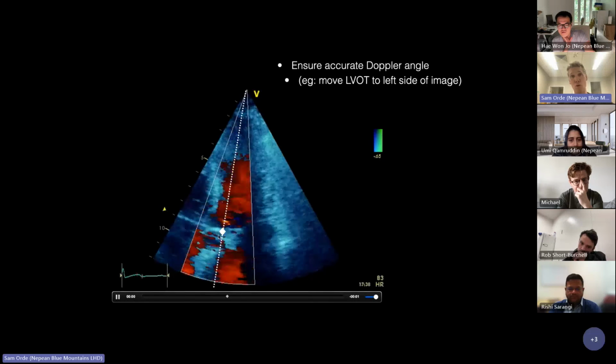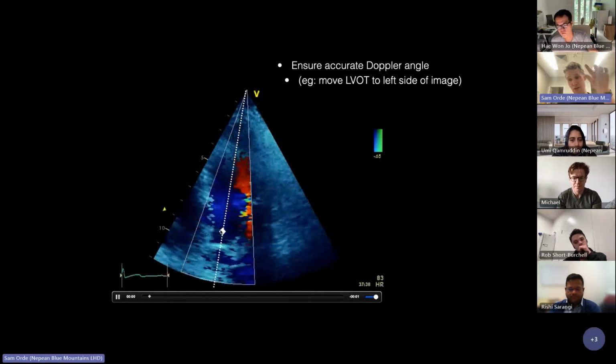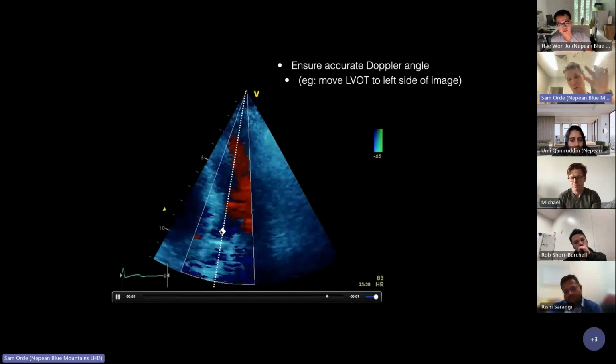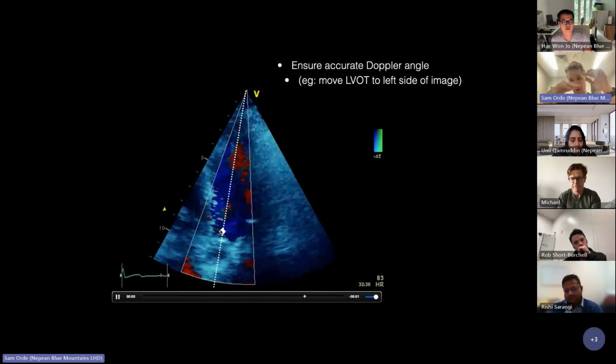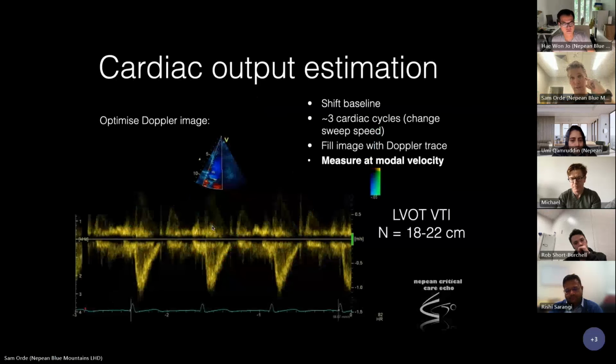You're going to want to put your pulsed wave Doppler gate so that you're only focusing on blood flow through the same place that you measured the LVOT diameter. Where you measured that, at the base of the aortic valve cusps, is where you want to put your little cursor. And how do you know that you're in the right spot? Because you get a closing click.